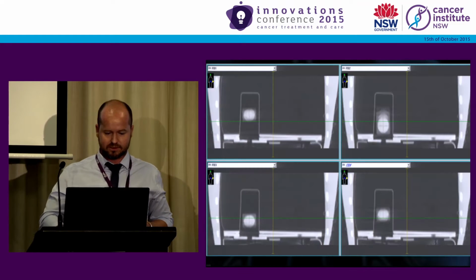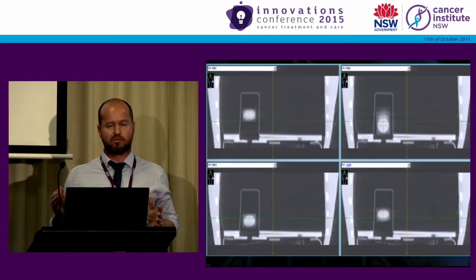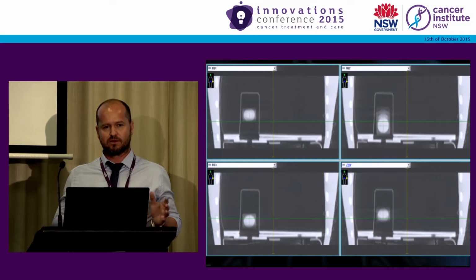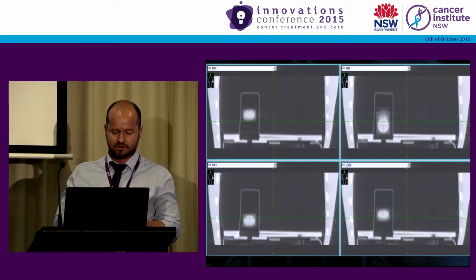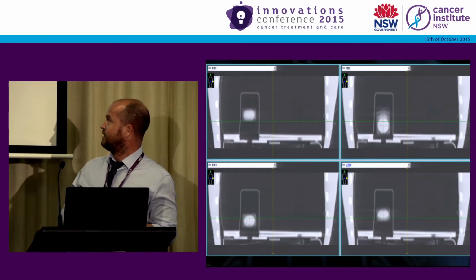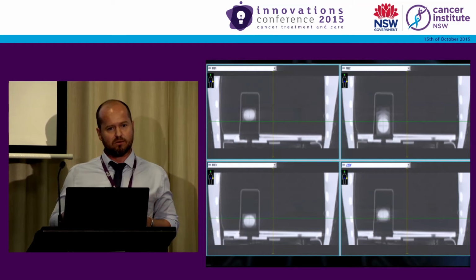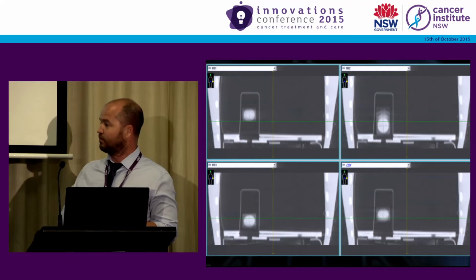What I did was I performed a conventional CT on this and then repeated it 3 times without changing anything, just doing the exact same scan, so they should be quite identical. But as you'll see, after each reconstruction, the shape and position of the tumour changes quite dramatically. So there's an interplay going on between the motion of the tumour and the motion of the bed as you acquire the image. So it can be somewhat of a lottery, the image that you end up with.